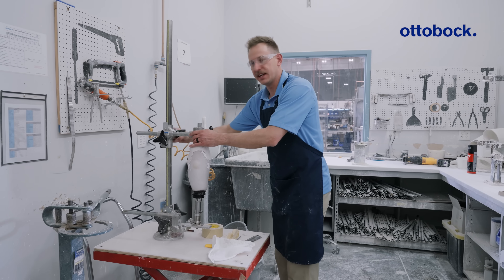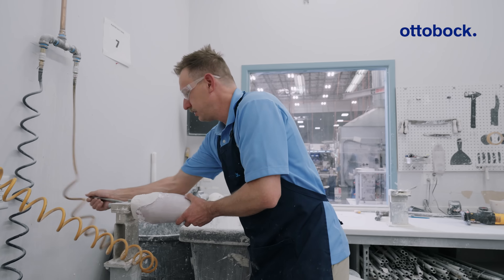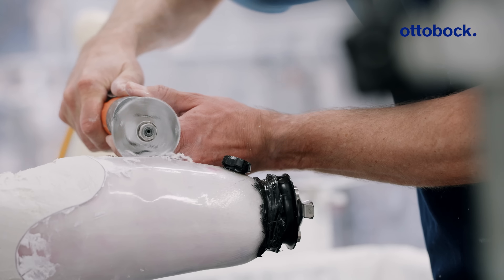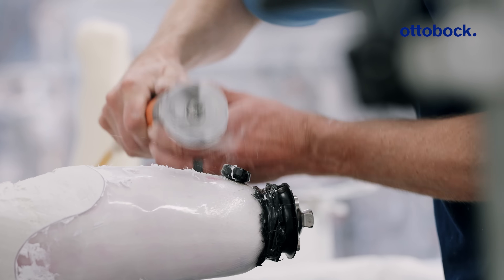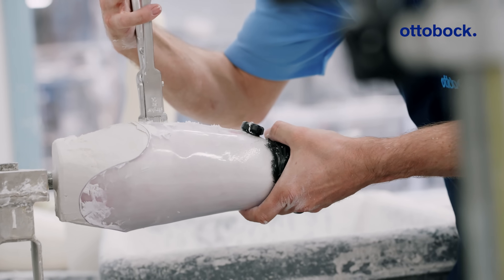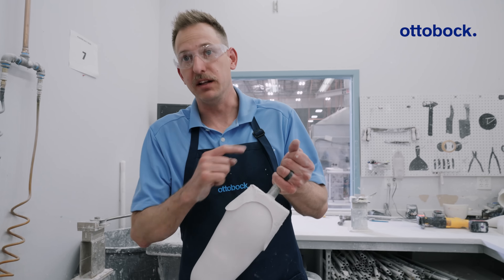Now the plaster is set after just a very short amount of time and we are ready to remove it. We're going to cut down the posterior wall, making sure not to hit the valve, looking for a depth that's just below your thermoformed plastic. Insert the cast spreaders and slightly depress while moving. Now we're ready to finalize our trim lines.